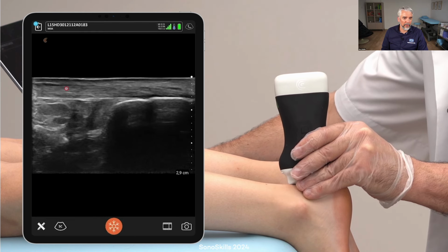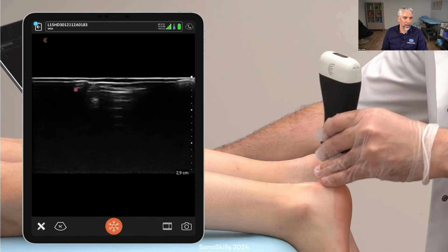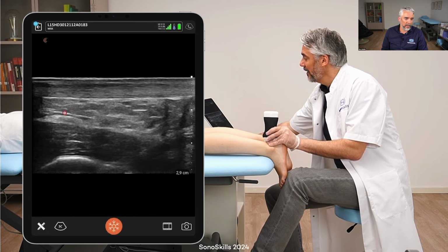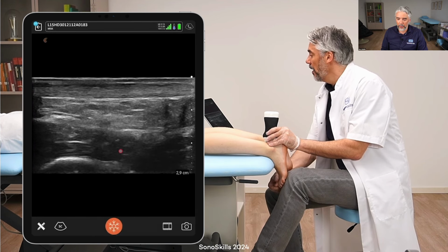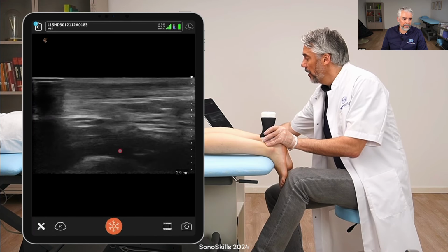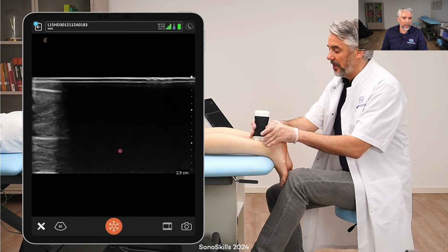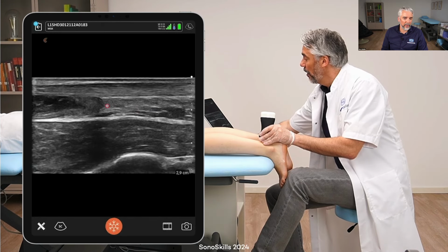That is the thickness of the Achilles tendon. We're going to follow the Achilles tendon up to proximal. And in the depth, you can see Kager's fat pad, and one level deeper, that is the FHL, the flexor hallucis longus. Look at my hand there, wiggling the toe, and you can see the flexor hallucis longus moving. And slightly higher, this is a nice point. There you can see that, well, this is Kager's fat pad, and here you can see the start of the soleus muscle.